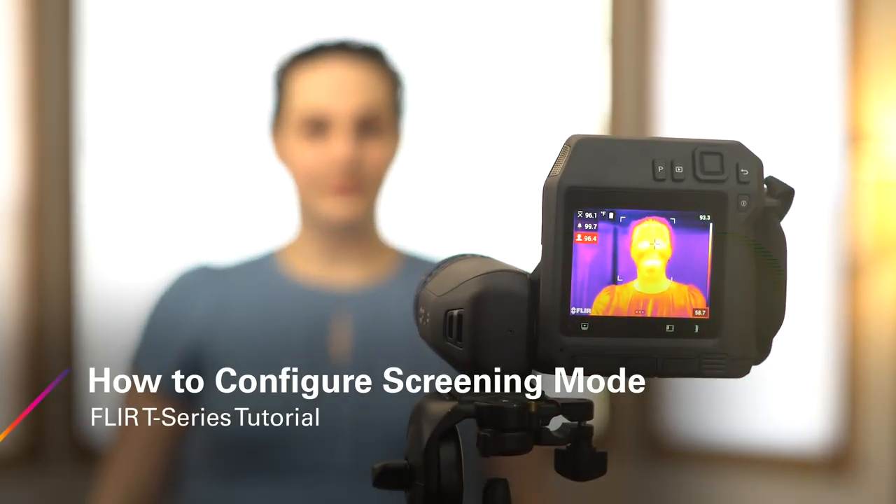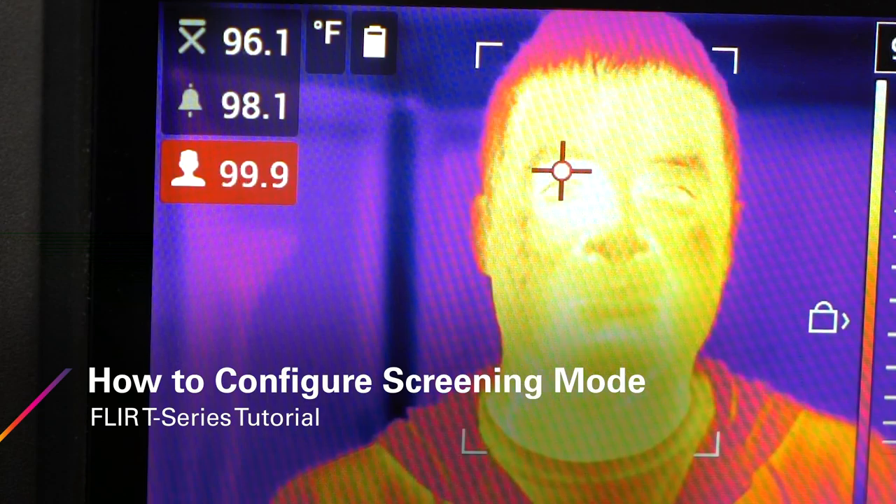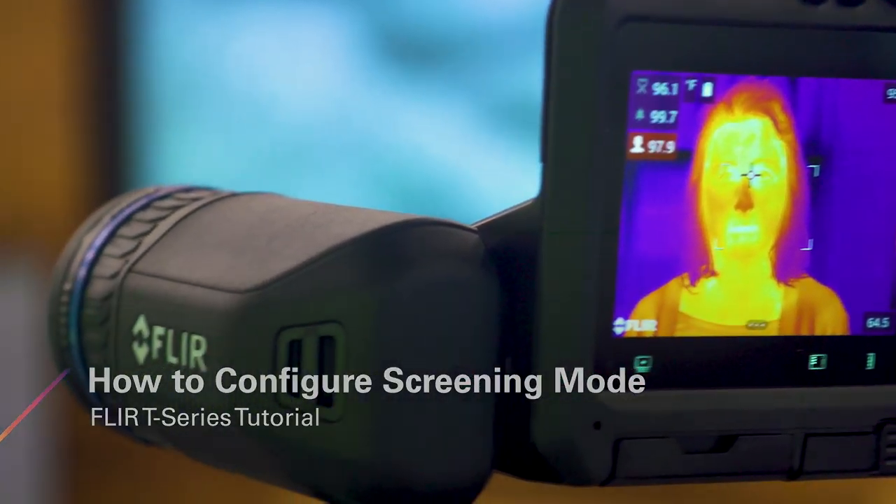This video demonstrates how to switch from the factory default settings to the screening mode on a FLIR T540 thermal imaging camera.